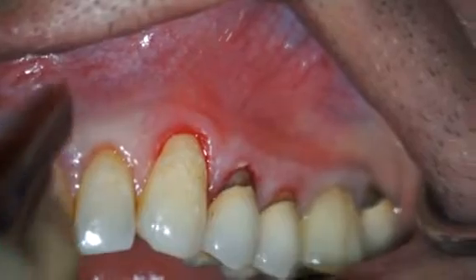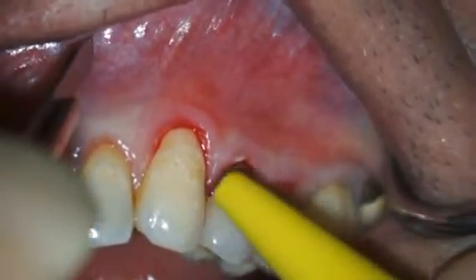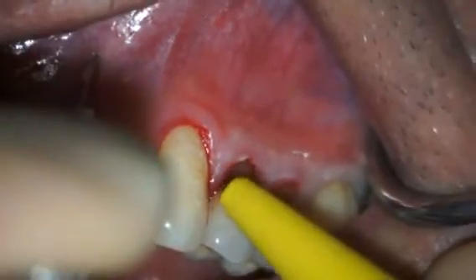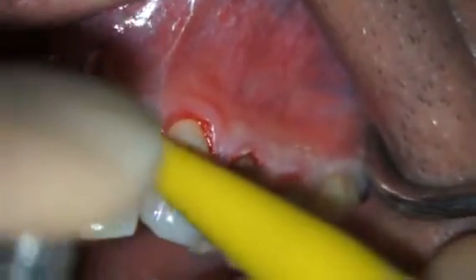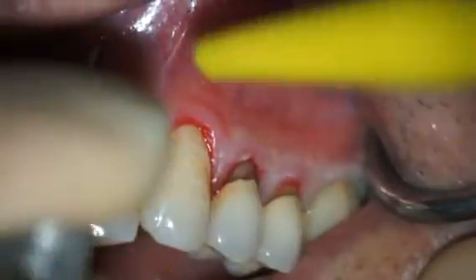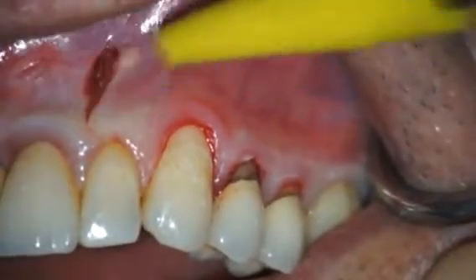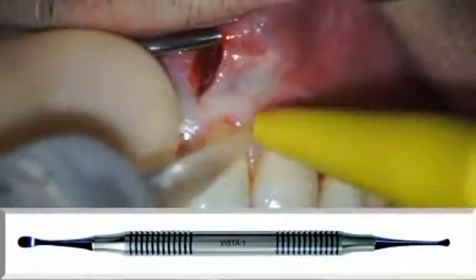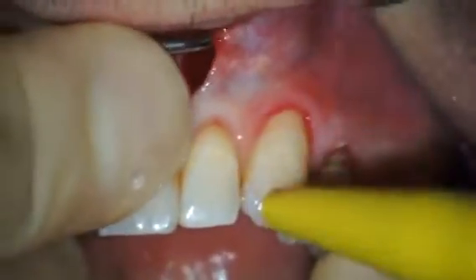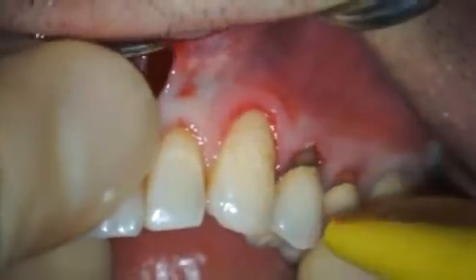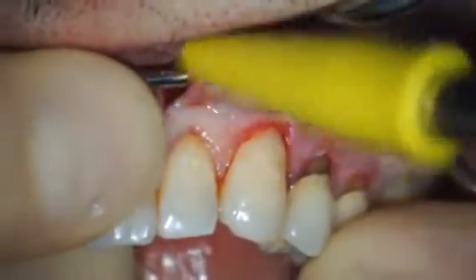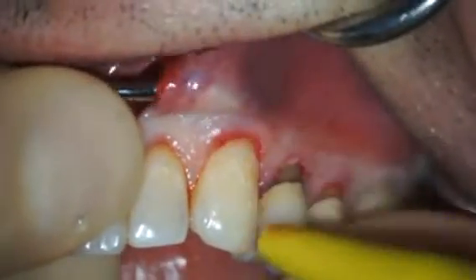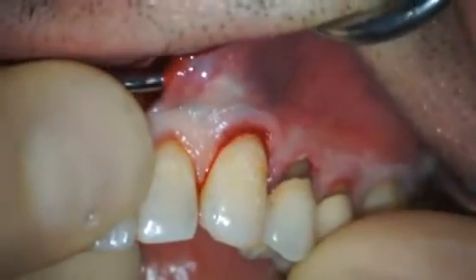The VISTA technique calls for a vestibular access incision, which in this patient is placed between the left central and lateral incisor teeth. The incision is approximately 1.5 centimeters long and is made through the periosteum in order to allow the creation of a subperiosteal tunnel. Beginning with a VISTA 1 straight-shanked periosteal elevator, a subperiosteal tunnel is prepared, extending just beyond the most distally treated tooth. In order to avoid soft tissue perforation, the elevator must remain against the bone at all times.